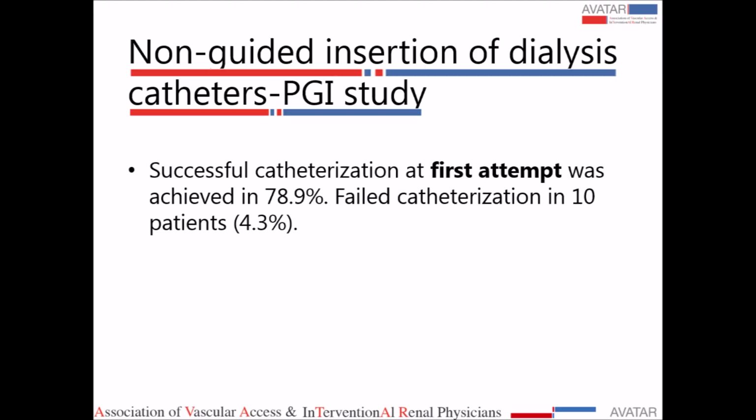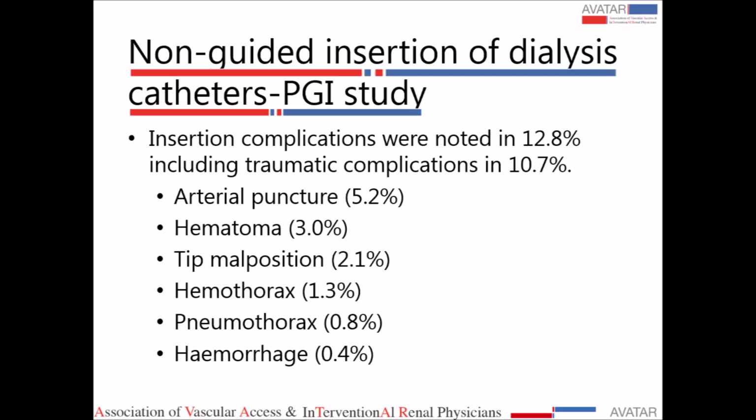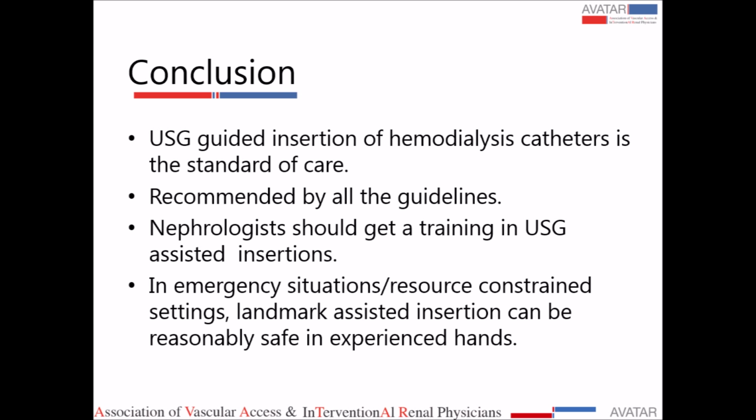So what I mean to say is that whenever we were using non-ultrasound guided insertion, we noted a comparable success of catheter insertion, but at the cost of a slightly higher complication rate. So to conclude, ultrasound guided insertion of hemodialysis catheter is now the standard of care. We should always try to use ultrasound guidance, and it is now recommended by all the guidelines.